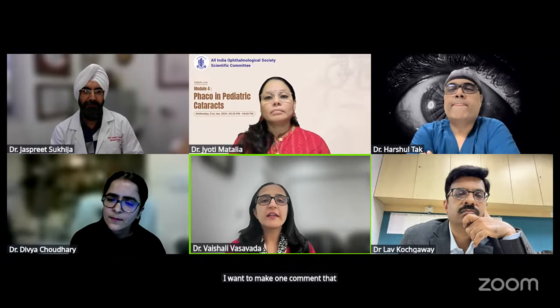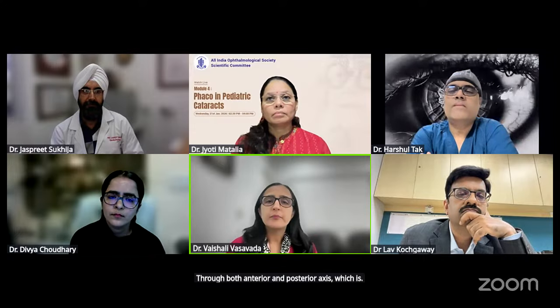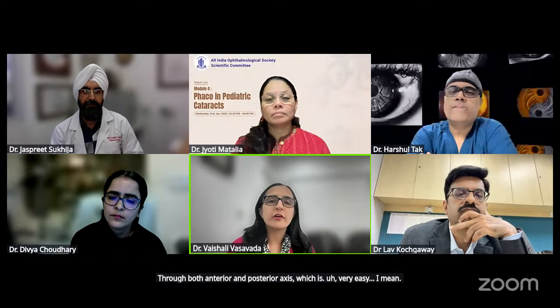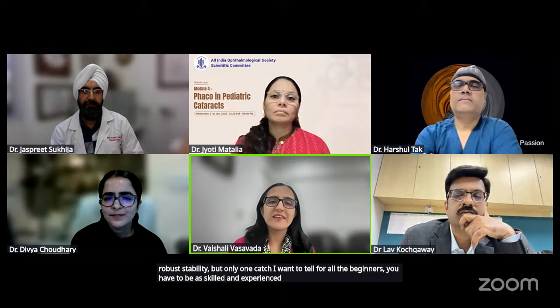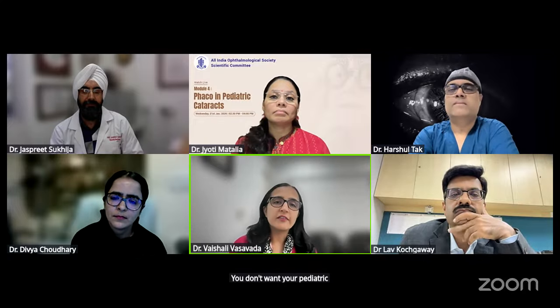I want to comment that what Dr. Sukhija said is a very good idea of doing a bicapsular capture. That means put your IOL first in the sulcus and then push the optic through both anterior and posterior capsulorhexis, which is very easy. It has robust stability, but there is one catch I want to tell all beginners: you have to be as skilled and experienced as Dr. Jaspreet, because in case the capture comes off, you don't want a pediatric IOL in a sulcus unless there is already a traumatic large defect or something.